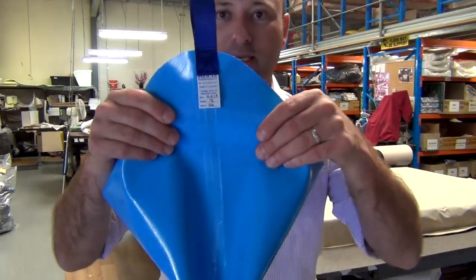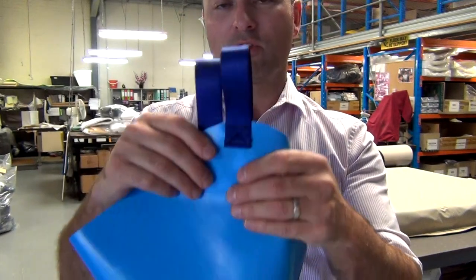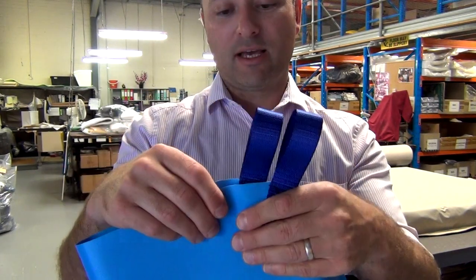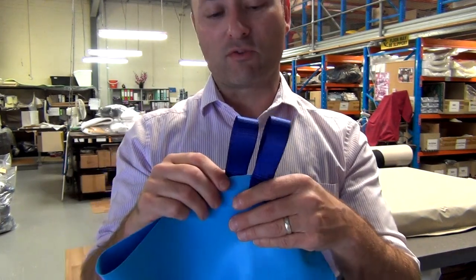It's got one seam. It's a heat sealed seam so you can wipe it clean. The straps are webbing. There is stitching. We decided to use stitching instead of vinyl because it could create a weak point if we had to use vinyl there.